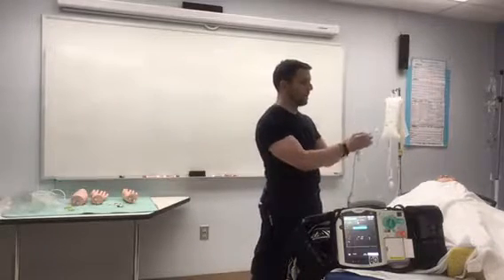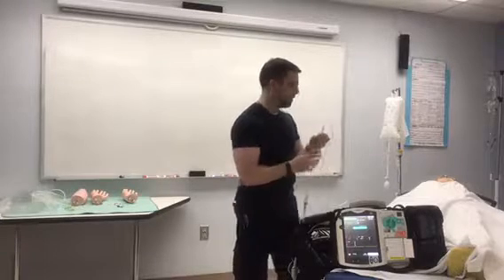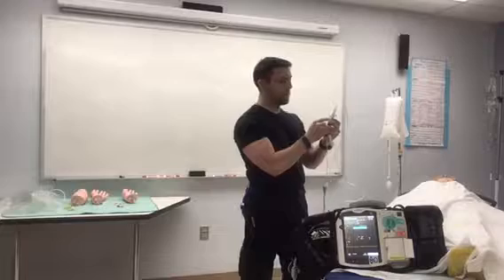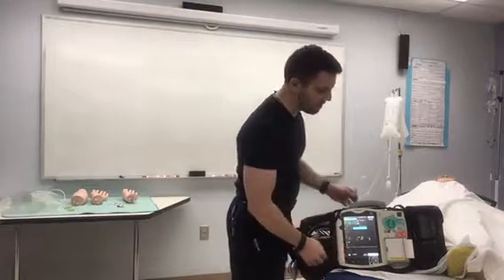What we need to do is turn the valve off to the patient, and we need to allow the transducer to know where we are for atmospheric pressure. This machine doesn't know the difference whether we're sitting at sea level versus sitting at a hospital in the Rockies at 10,000 feet. It doesn't know the difference, so we actually need to zero it.